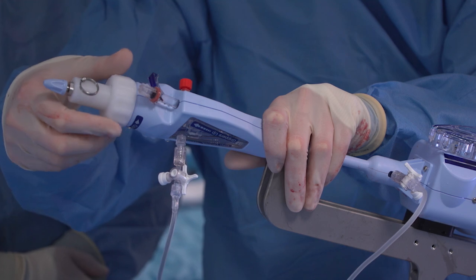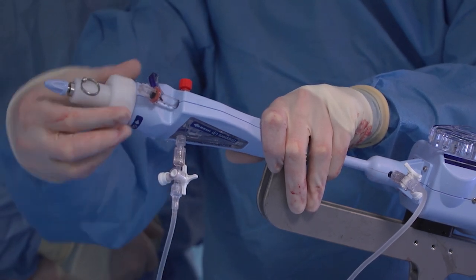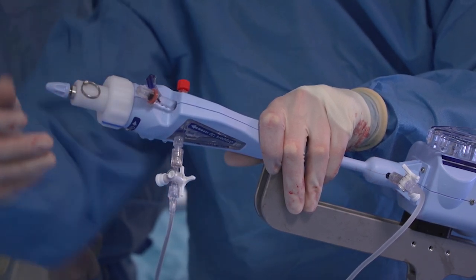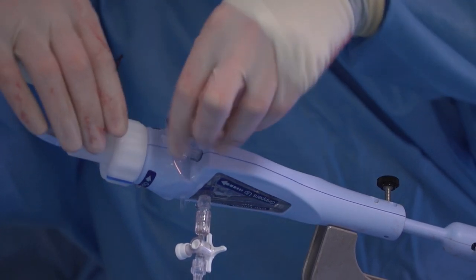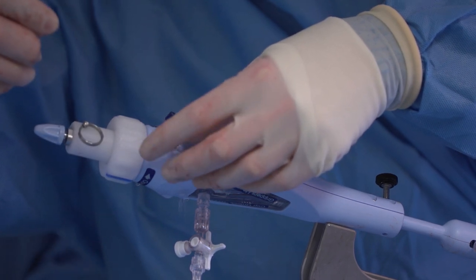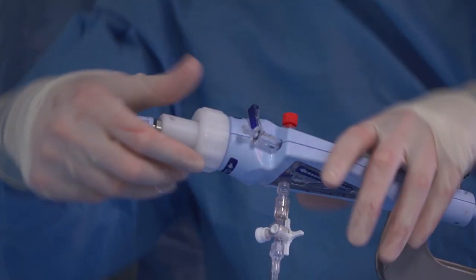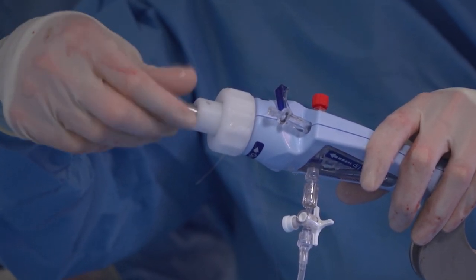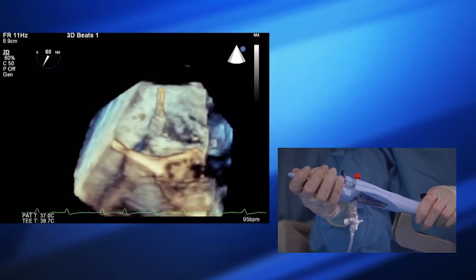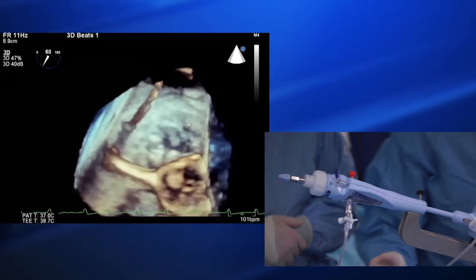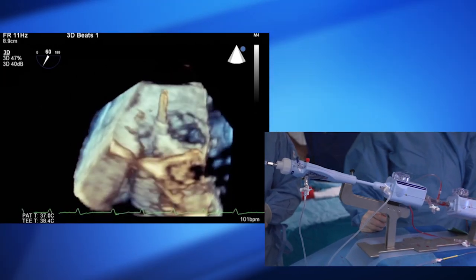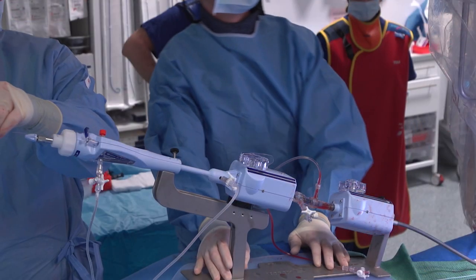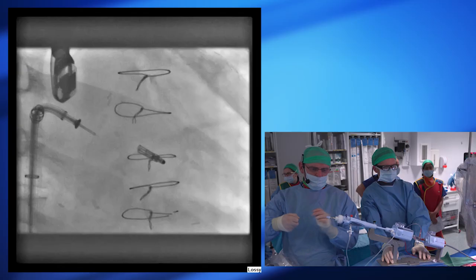To release the clip: the grippers are down, the lock lever is down, and I've checked the clip is fully closed. I'm now going to test the lock — open the clip, or try to open it — and it does not unlock, which tells us the lock is working. Move back to neutral, half a turn clockwise. This is the gripper line — making sure that when I pull it, the line moves freely without too much resistance. That's moving nicely. Now remove the lock line, pull the grenade pin, expose the groove, and then eight or nine turns. I'll now let go of the clip — that's nicely off. The grip line is still attached, so we can still retrieve the clip if needed. The key point is that the clip is very stable, moving with the heart but not more than that.